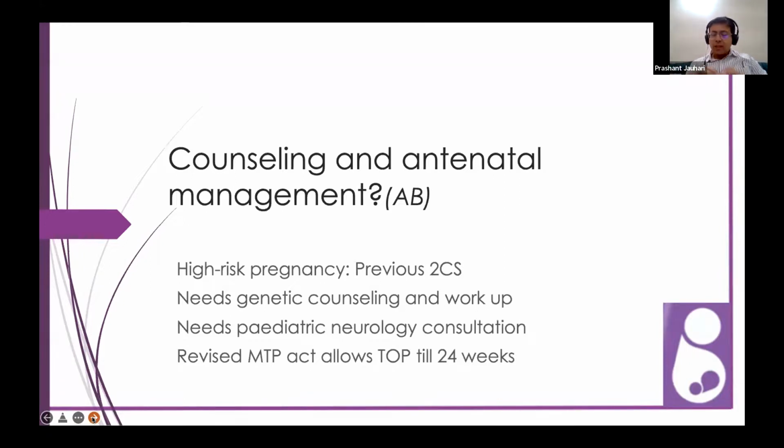Now, if we look at this case, which just has heterotopias, and has not carried the baggage of the previous kid with all the other abnormalities, I'll not be very happy, because I know that in later imaging, we might see some of these abnormalities. But currently, I would consider that possibly there is some sort of migrational abnormality, some sort of lissencephaly, along with this heterotopia. I'll counsel them that this kid may have seizures early or maybe later, along with developmental delay. This is my possibility.